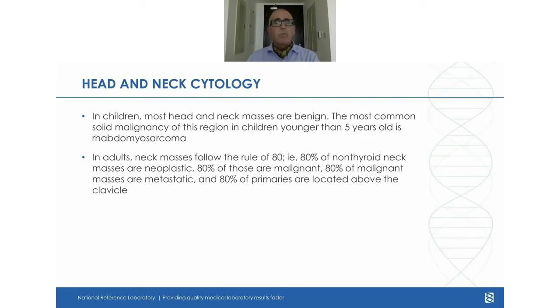In children, we used to do quite a few FNAs of lymph nodes, enlarged lymph nodes in the pediatric population, especially if the lymph node had been there for a while. It's very good in order to send it then also to microbiology.